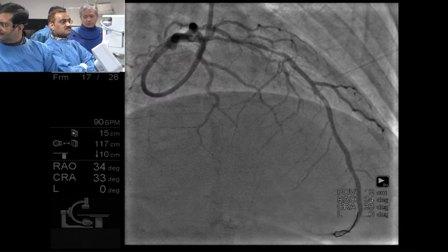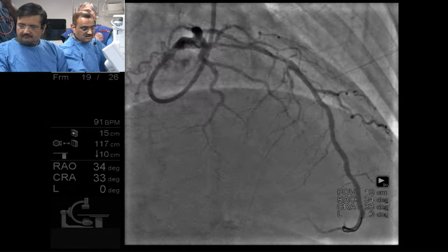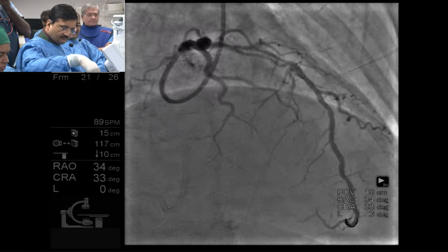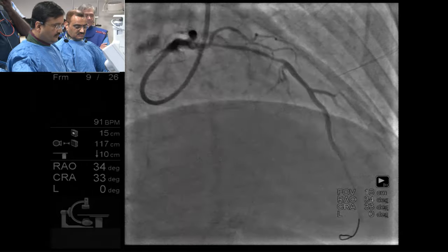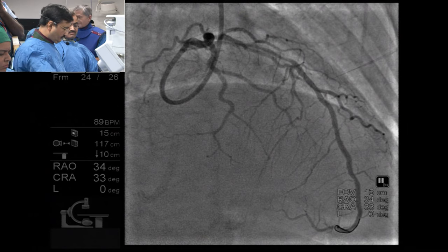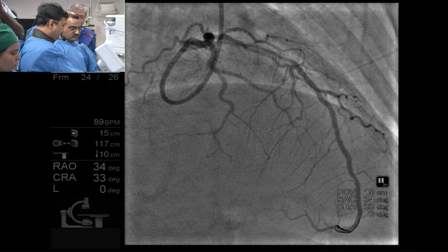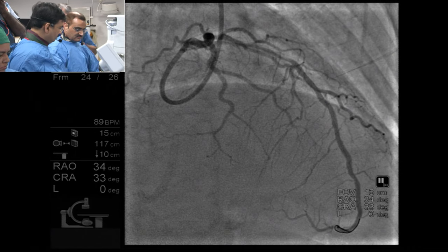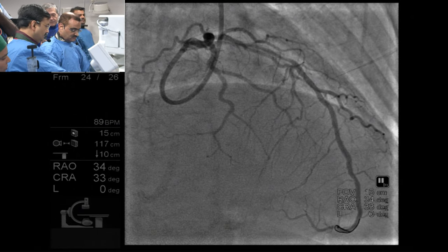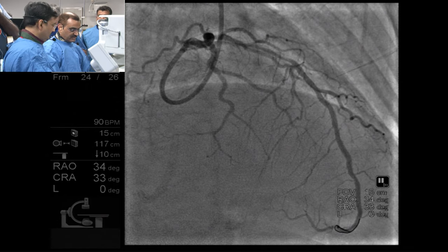So you're using a 2.5 high pressure balloon to prep the lesion? That's your plan? He's going to try to deploy a stent primarily. Well, primary stent it. Primary stenting. Are you sure your stent will expand well? I think so, with the IVUS findings. We'll do the IVUS afterwards. What happens if it's not expanded? Then what is the plan? Post dilate. I think it's a little bit risky to post dilate. No, I looked at the IVUS images here. It will expand.